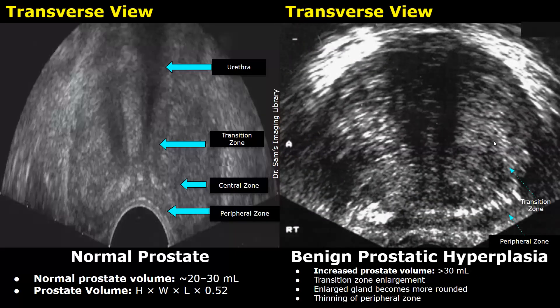In this image, a rounded enlarged prostate is seen. The normal prostate is usually somewhat triangular or pyramidal in shape, especially at the apex, but in BPH it appears more rounded. In some areas, the surgical capsule can appear hyperechoic — this is the surgical capsule between the transition zone and the peripheral zone — and the peripheral zone appears very thin.